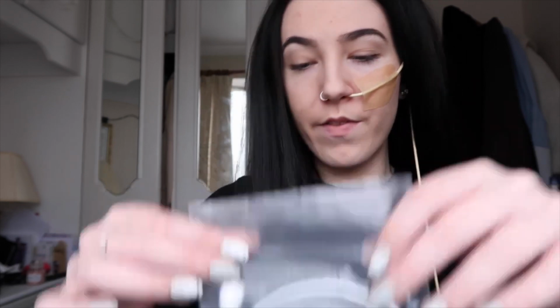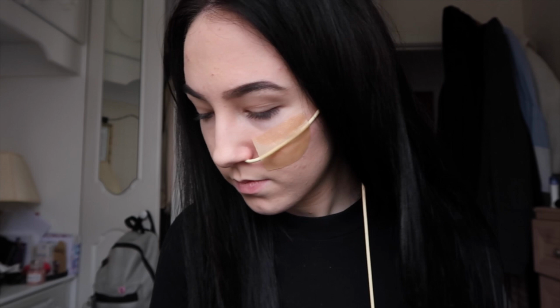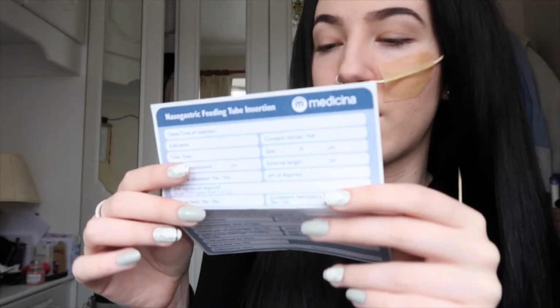So I'm just going to open the packet first of all. I'm going to pull out the tube, so it comes in an extra packet like that, and you actually get a bit of tape with it. So you get a bit of tape that you can use to stick it to your face, but I'm just going to use this tape. And then you just get like a little instructional sticker that just says nasogastric feeding tube, blah blah blah. This is more for the hospital, I think.